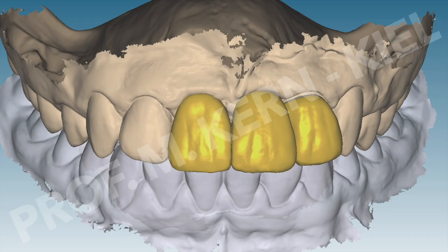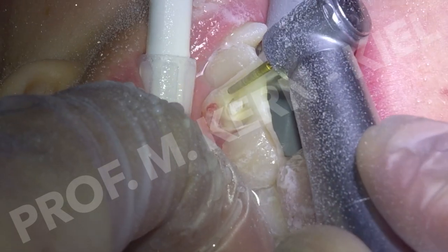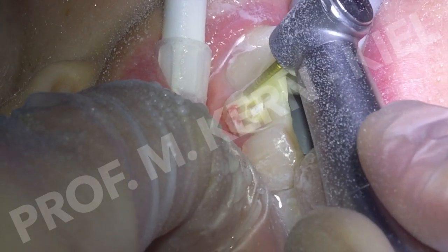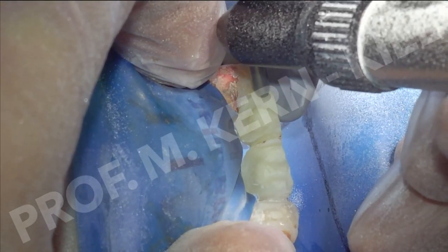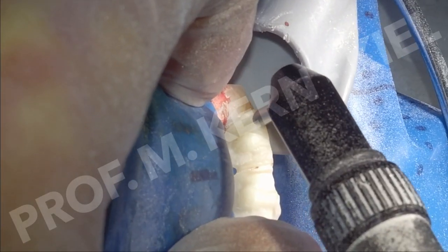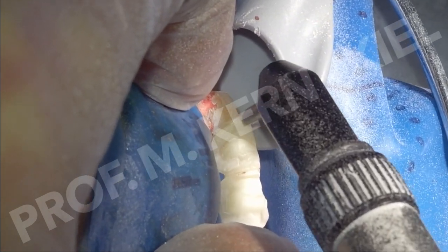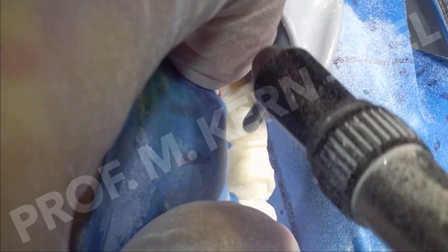Since the splinting of the lateral incisors and their roots were intact, it was planned to remove the crowns of the central incisors and replace them with ceramic pontics. The natural tooth crowns were reduced down to small remnants on the splint using diamond burrs, while the remaining tooth and luting materials were treated with 50 µm alumina particles under rubber dam isolation to avoid damaging the zirconia ceramic surface.